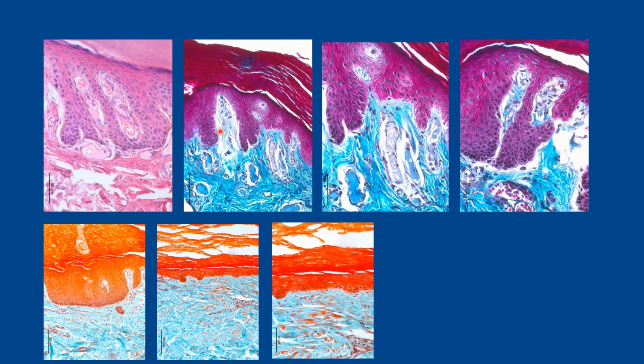Okay, coming back again to show the position of the Meissner's corpuscle. Actually, in between the epidermal projections, this is the dermal papillae, and in this layer you see certain elongated structures. These are the typical Meissner's corpuscles. So the nerve is in the center. The nerve takes a helical or zigzag course, and around the nerve there are certain cells covering the nerve. So it gives a typical appearance of the Meissner's corpuscle.